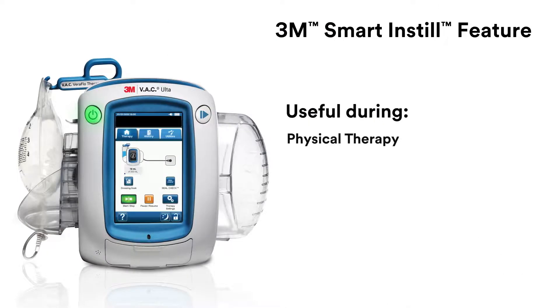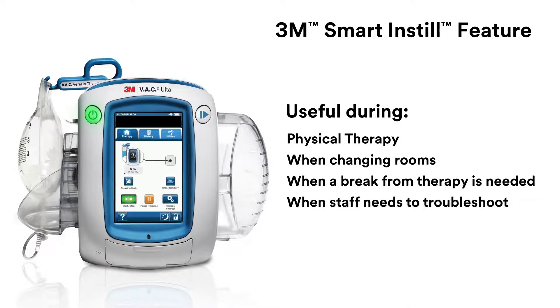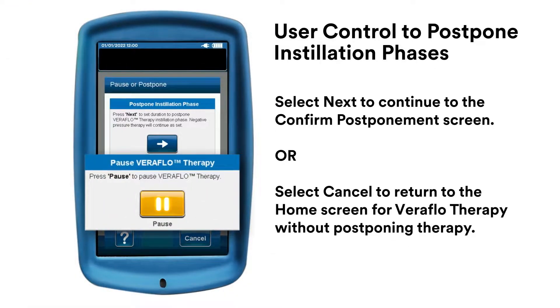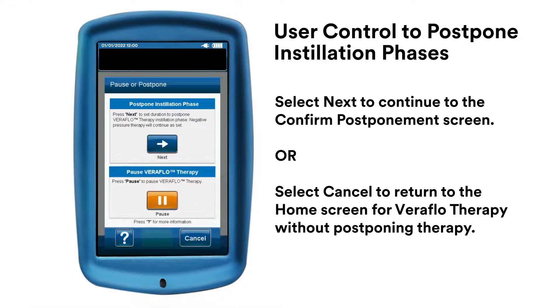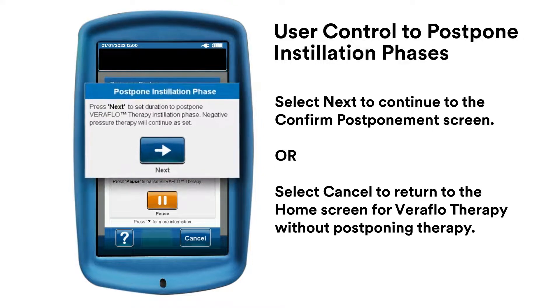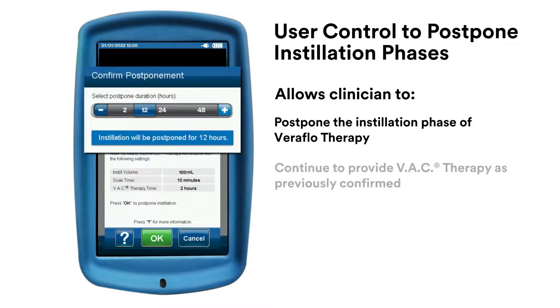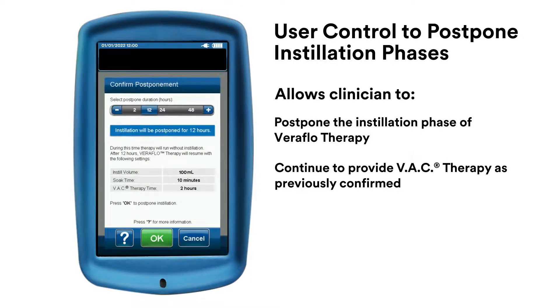Two key features give you control when setting up VeriFlow Therapy. Select the Pause button on the home screen to pause VeriFlow Therapy at any time. To postpone the instillation phase of VeriFlow Therapy, select the Next button. Use the Plus or Minus button to select the amount of time to postpone the instillation phase, then select OK to continue with postponement.